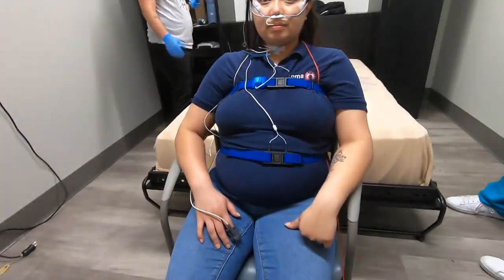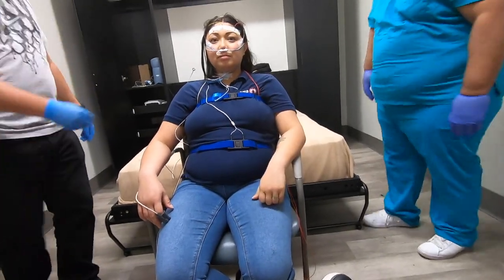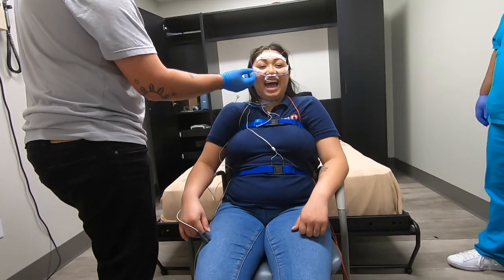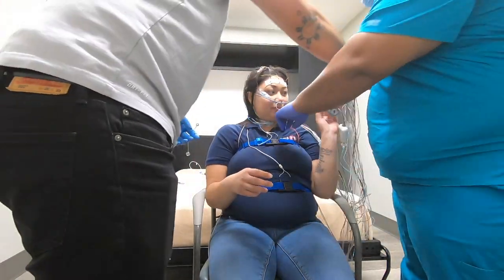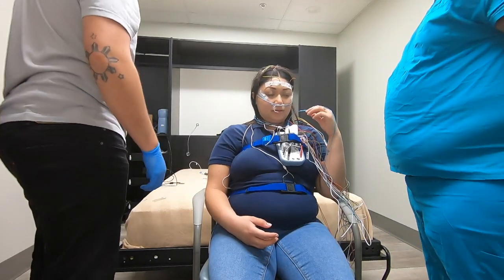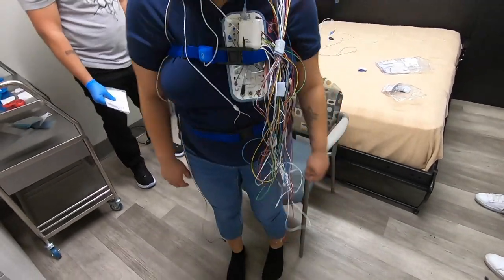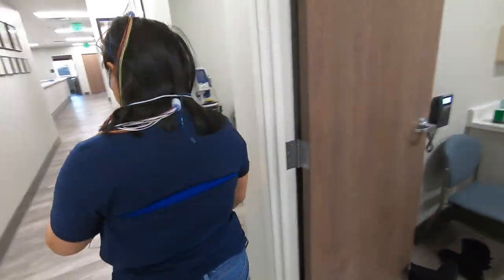Would you be able to sleep in all of this? I don't know — I feel like I'm going to choke. She also has a snore microphone on her neck; that obviously picks up snoring. Usually there is a thing that goes around the neck and it just hangs there. So that's what patients feel every single time they get set up in bed. It's all self-contained so you can go use the restroom if needed. I feel like a marionette.